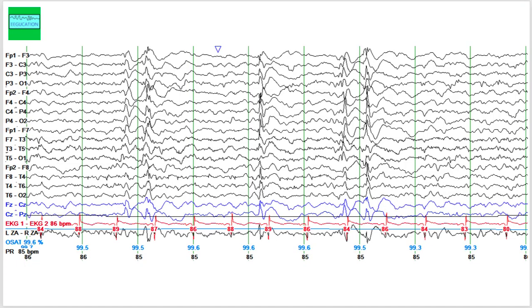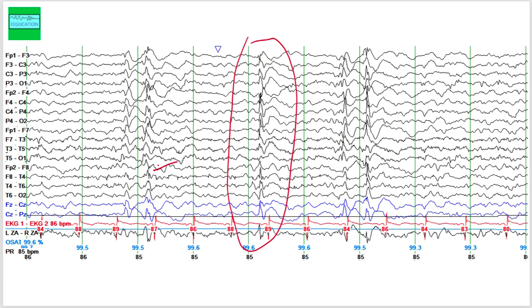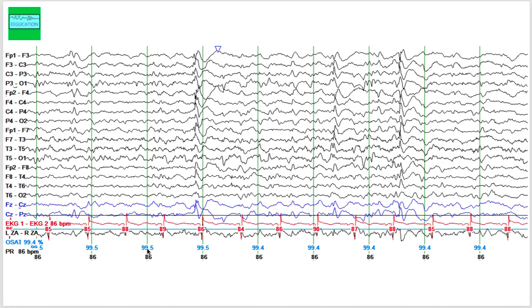Coming back to our EEG — what we are seeing here is a lot of generalized spikes and spike-and-wave discharges. You can also appreciate some poly spikes. This is a poly spike because it's more than one spike in the complex. So you're seeing generalized spikes, generalized poly spikes, and previously we saw independent sharp waves in the bitemporal head region. The patient is now asleep — no eye blink artifacts, less muscle artifact — and during sleep, the generalized spikes are way more frequent.